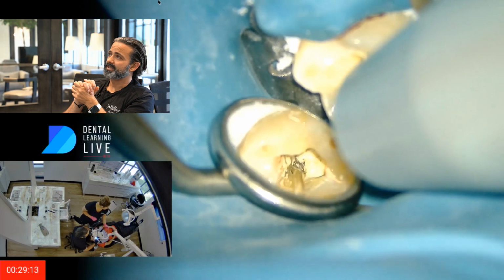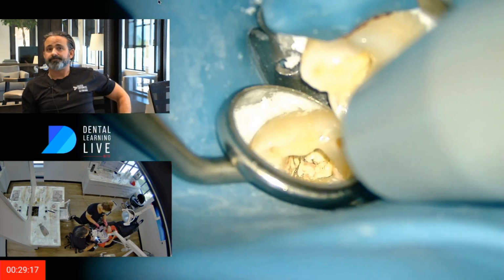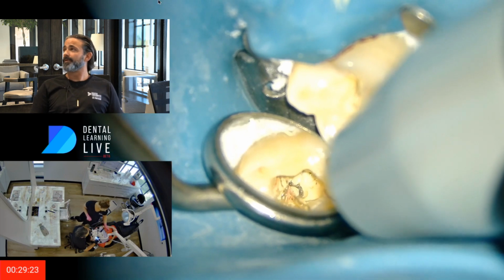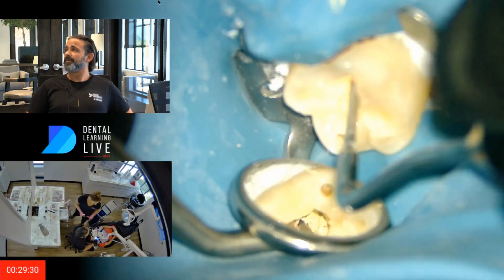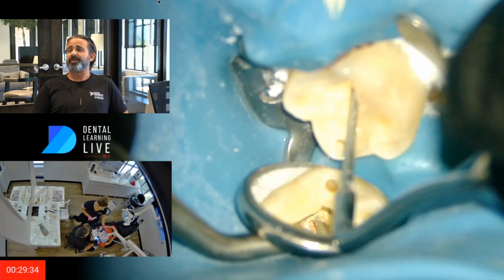And then back to the mesiobuccal. Down pack. And then it's just a matter of cleaning up the floor.